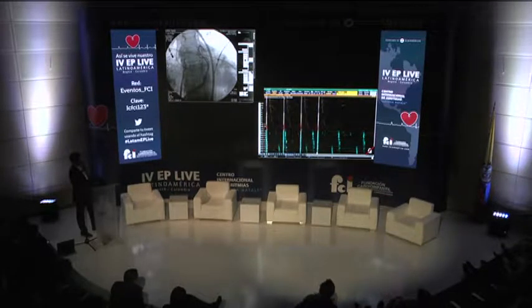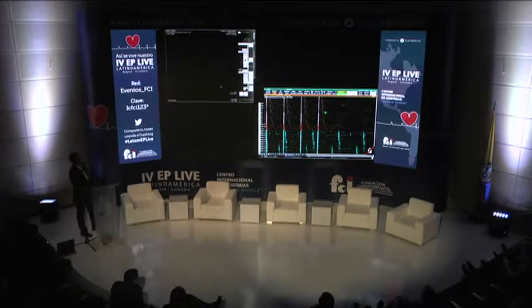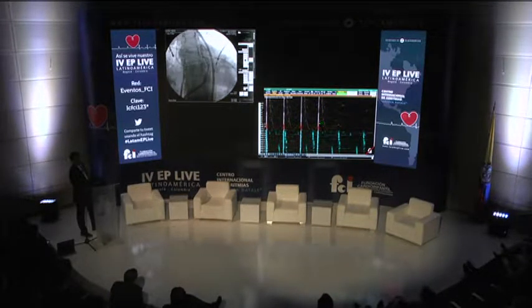No, there isn't much artifact. I don't know whether we captured anything or not. Well, let's wait for the extrasystole to see if we get a signal. The problem of unipolar stimulation is the artifact. You must make an effort to avoid artifacts, and that's one of the things we have to deal with when we are doing pacing. Well, here we have an extrasystole to check because we are anatomically close to 1314.